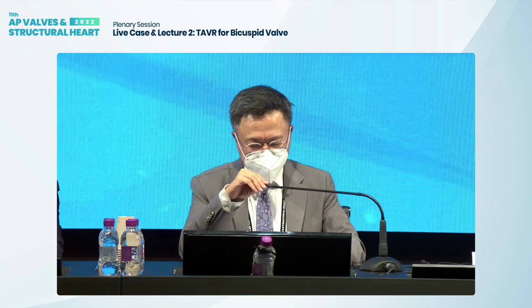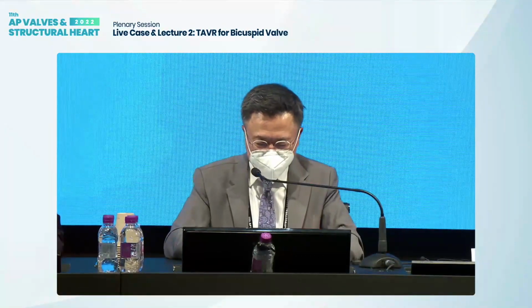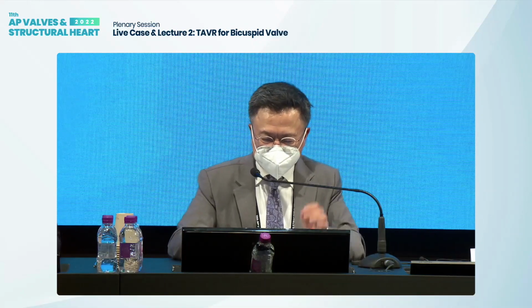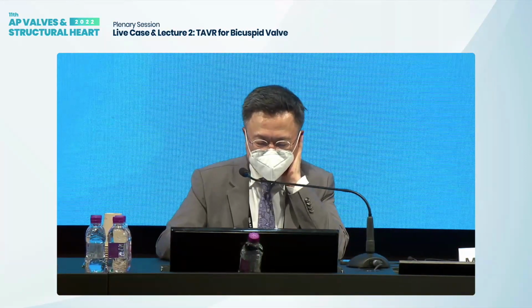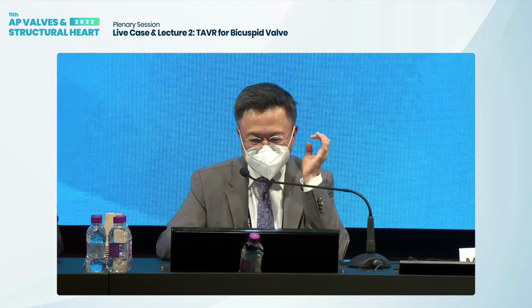So we're going to start with the live case from the Second Affiliated Hospital of Zhejiang University in China. Dr. Wang will be the operator. He's a professor there and has been really a pioneer of TAVR procedures in China. I think this case is going to be a bicuspid valve.